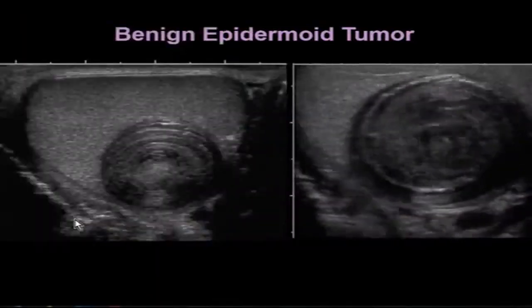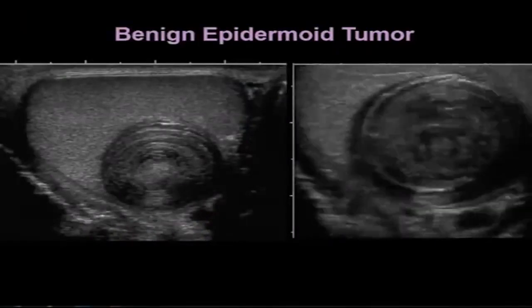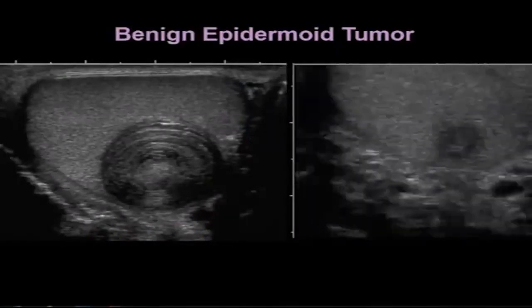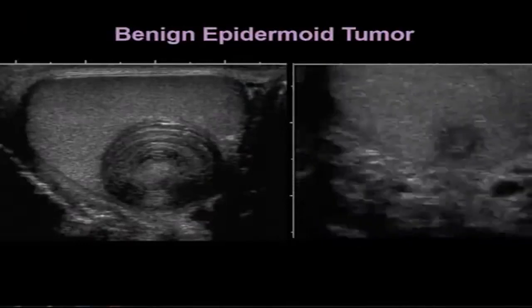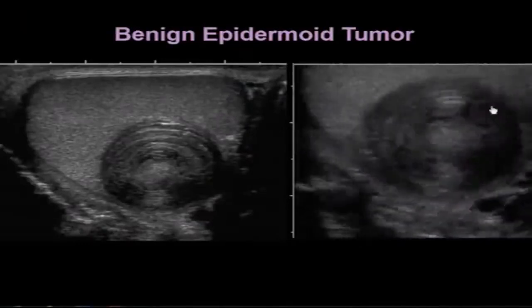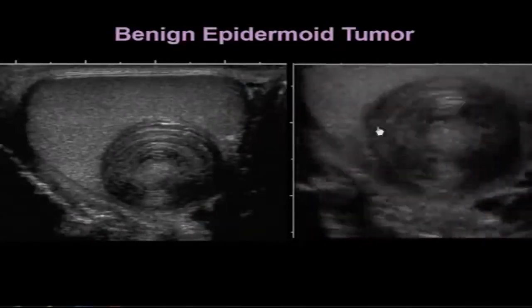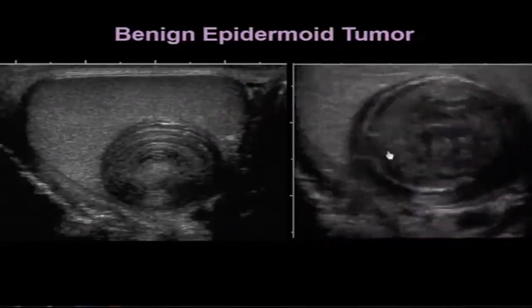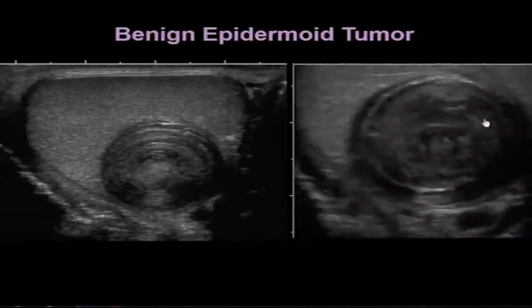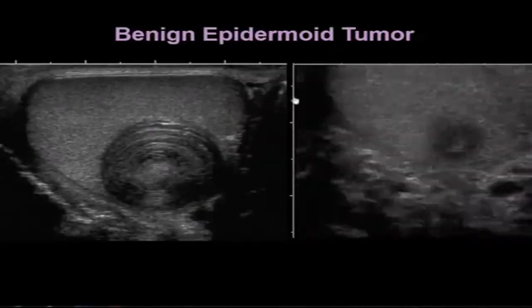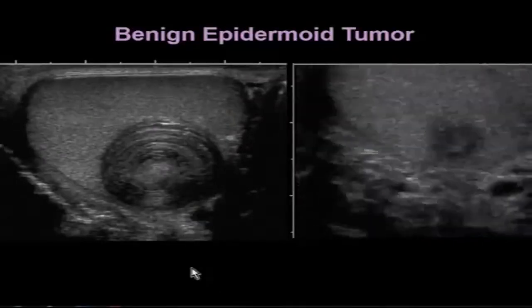An epidermoid tumor may sometimes have a characteristic appearance allowing us to diagnose it as benign. You can see the typical swirling or onion-skin pattern of this tumor — a well-defined lesion inside the testicle. This swirling pattern is typical for a benign epidermoid tumor.